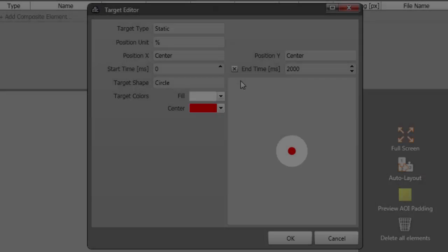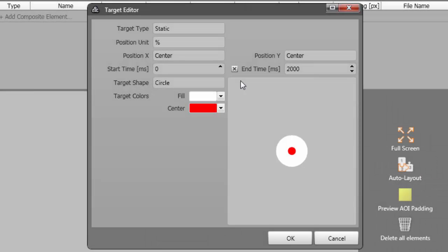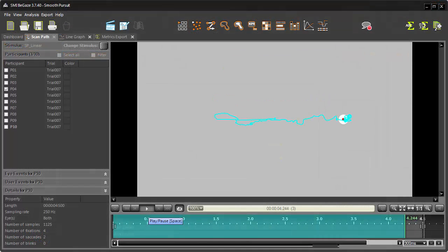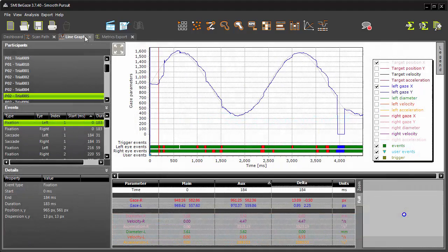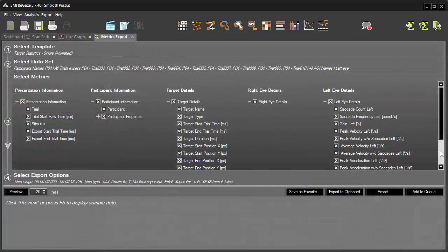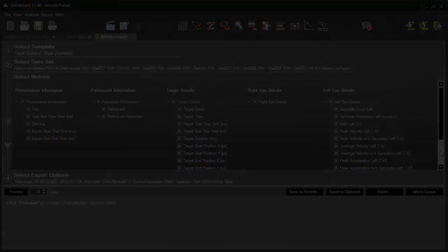In this tutorial, you learned how to design saccade and smooth pursuit paradigm experiments with Experiment Center, and how to analyze the collected data with the dedicated features of BeGaze. As you've seen, SMI Experiment Suite offers a full set of tools for the design and analysis of saccade and smooth pursuit tasks.